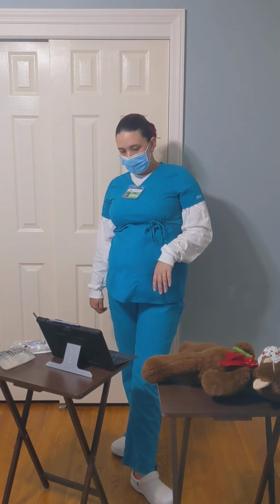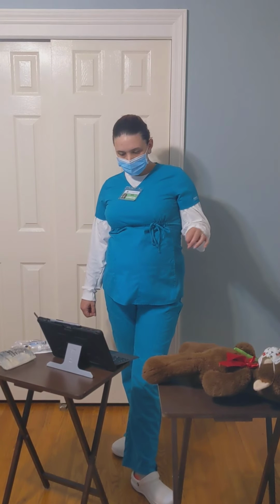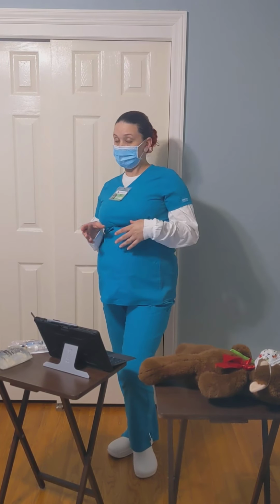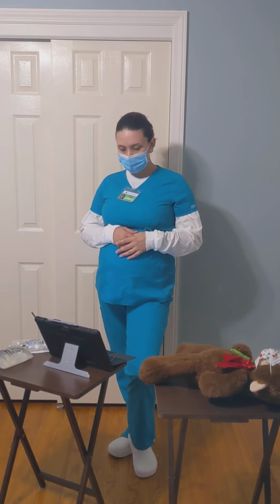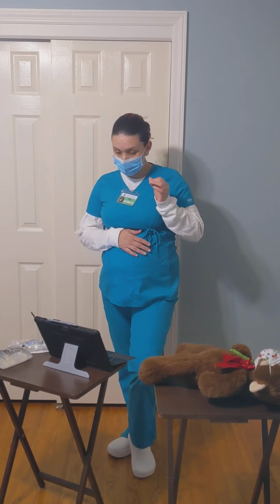So it says to infuse over 4 hours, drop factor of 10 drips per ml. If we needed to calculate a drop rate, it would be 4 drips per minute, but in this scenario, I'm going to use an IV pump in the room. So for 100 mLs to run over 4 hours, will be 25 mLs an hour.